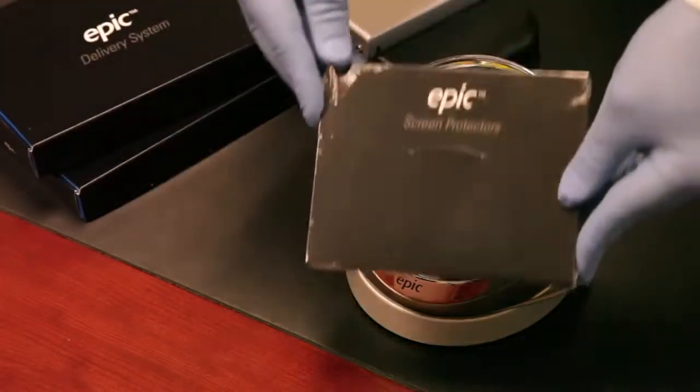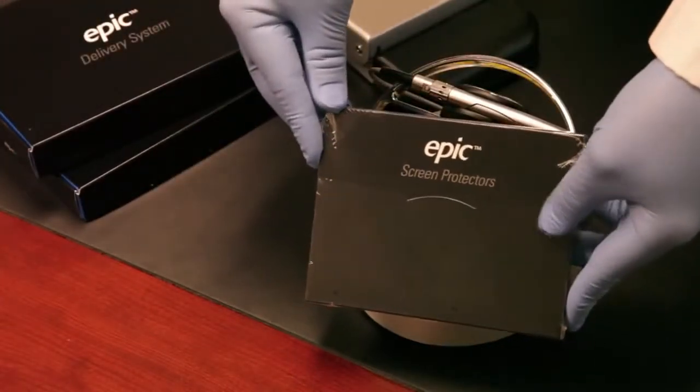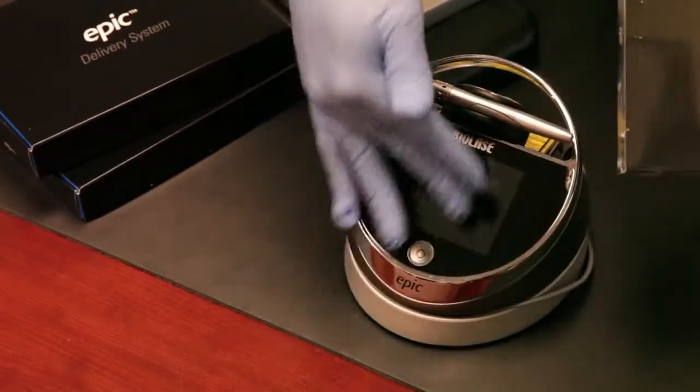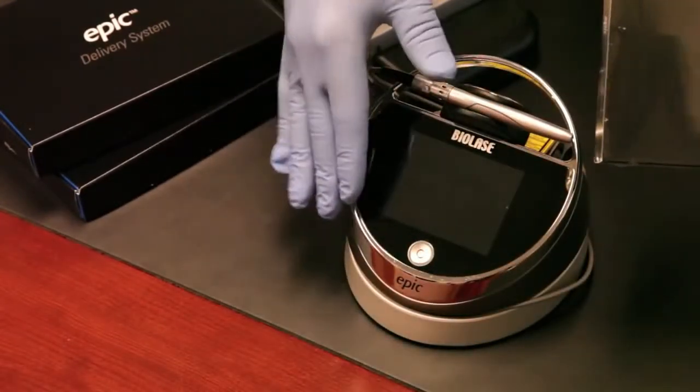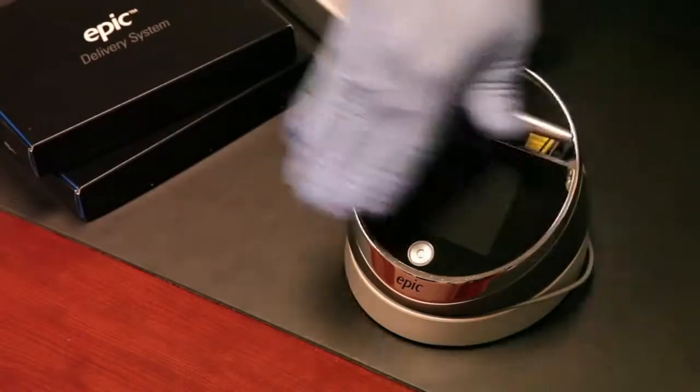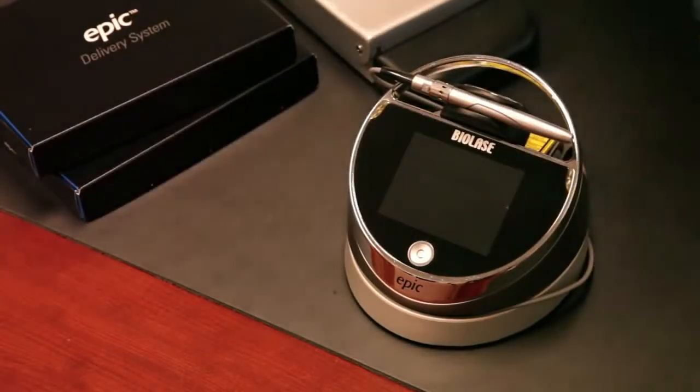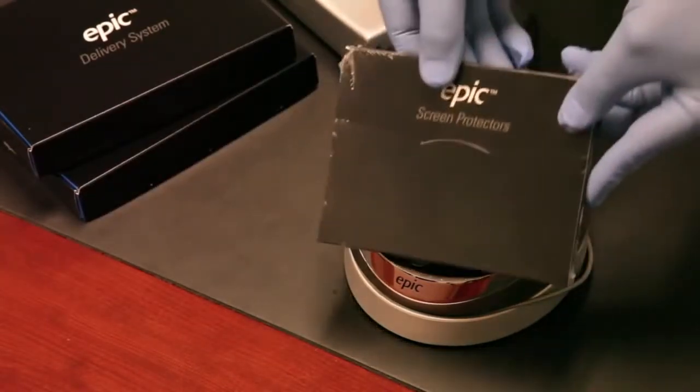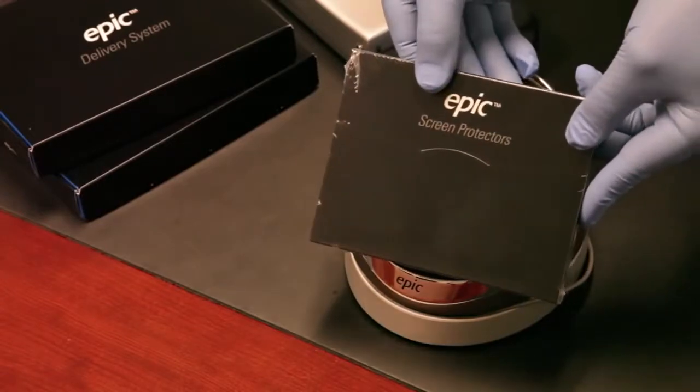With the basic Epic package you also receive a box of screen protectors. There's 30 of these in the box. You basically apply one to the front of the laser, and when you're done with the procedure you peel it off and throw it away, then simply wipe down with an alcohol wipe. These are very handy and we recommend using them with the laser.